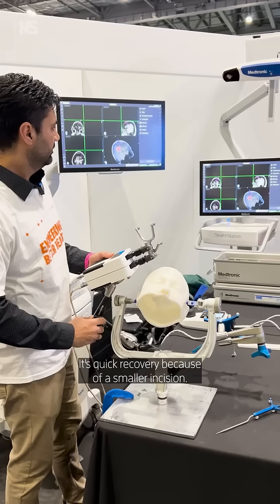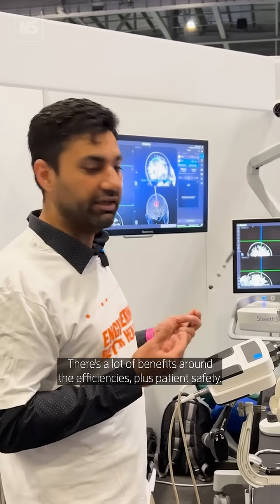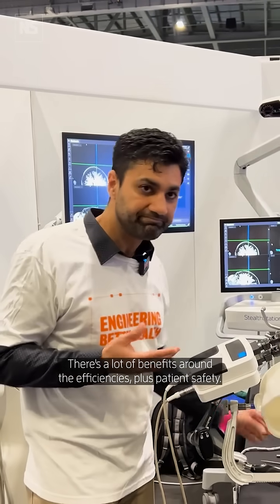It just speeds it up. It's quick recovery because of a smaller incision. There are a lot of benefits around the efficiencies plus patient safety.